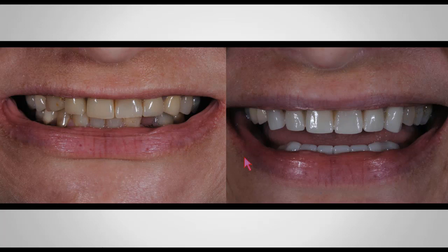So in a couple of weeks, those muscles are going to relax because there's no posterior contact. The elevator muscles are going to relax, and the depressor muscles, the inferior lateral pterygoid, are going to relax. And by that happening, the condyles should go up the slope against the eminentia towards centric relation. So my thought process is, when this patient comes in after 15 days wearing this anterior guidance prototype, she should be either pain-free or a lot better than she was before, and she should be able to communicate this with me, because she's not able to remove these prototypes. They're bonded to her teeth.